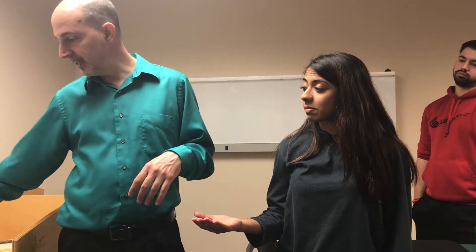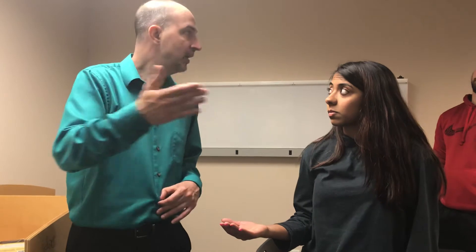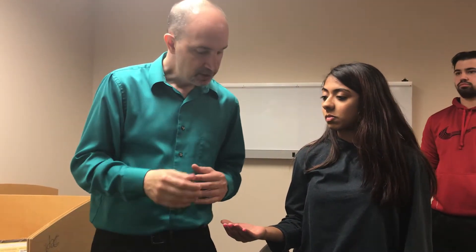I would also have the temperature here, which would tell me the temperature of the paraffin. Every clinic should have it — the temperature should be between two specific numbers. As the aide you're responsible for that. Depending on where you work, you would have a log where you write down the temperature each day, and the intervention might be to call maintenance if it's too hot or too cold.